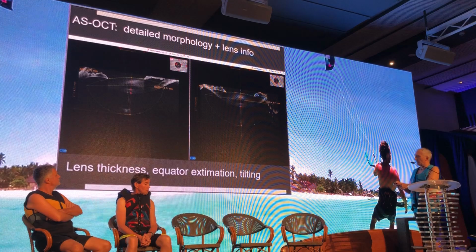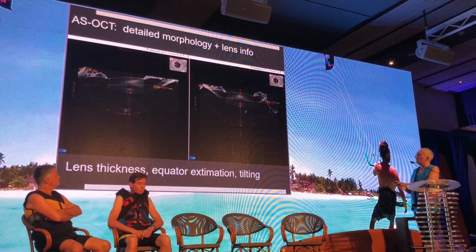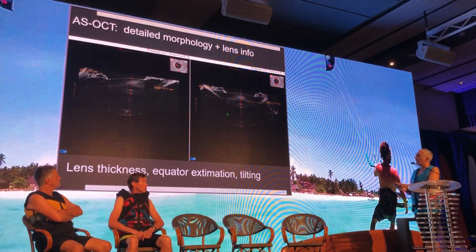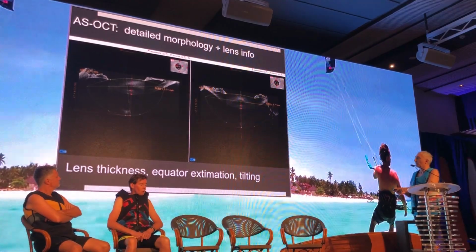You can go even deeper, although not together, and get some relevant information about tilting, sizing, curvature of the lens, whatever we might need for advanced IOL calculation, for example.